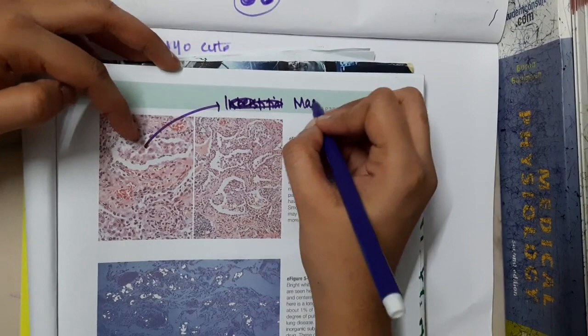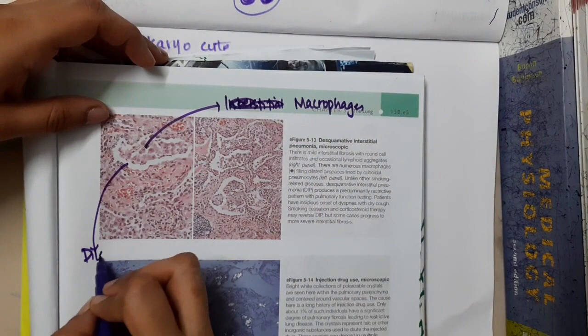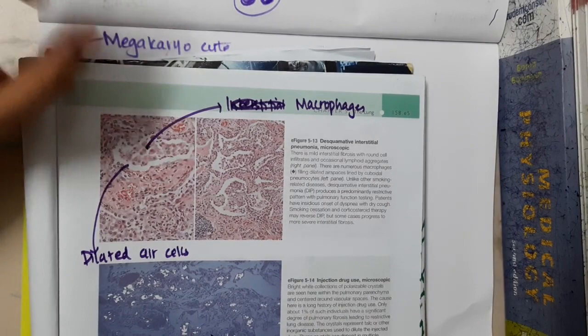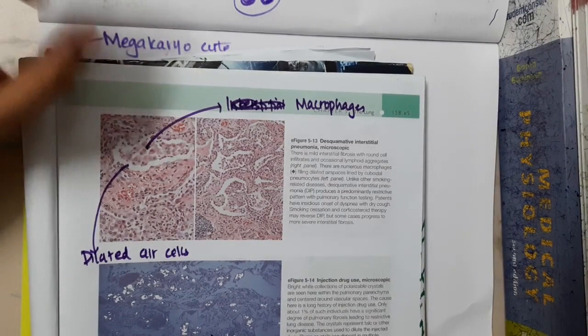Here you are seeing many macrophages are present. These are the macrophages which you see in dilated air spaces. These are the dilated air spaces with macrophages which will ingest the smoked particle. It is most commonly seen in smoking. This is DIP — Desquamative Interstitial Pneumonia.